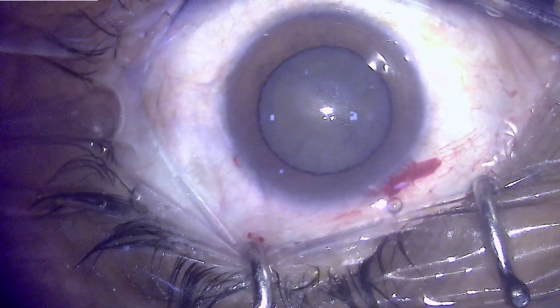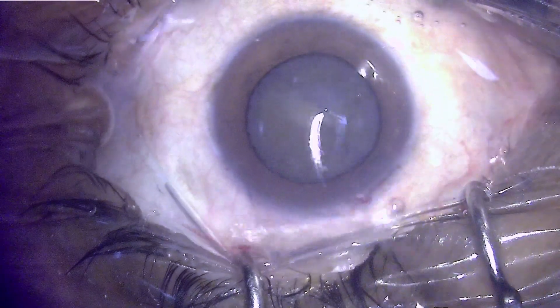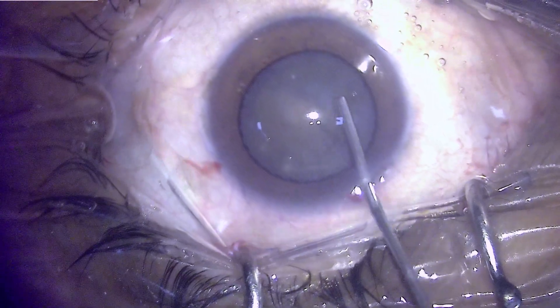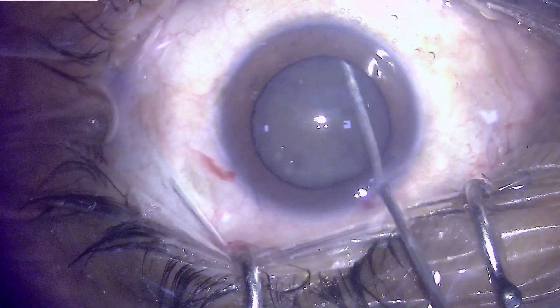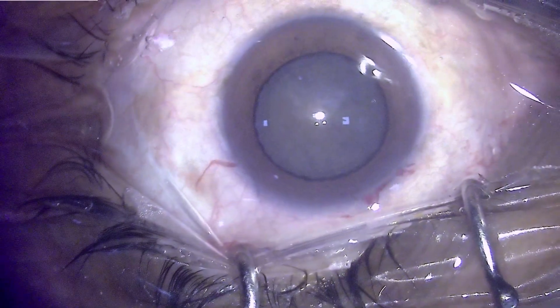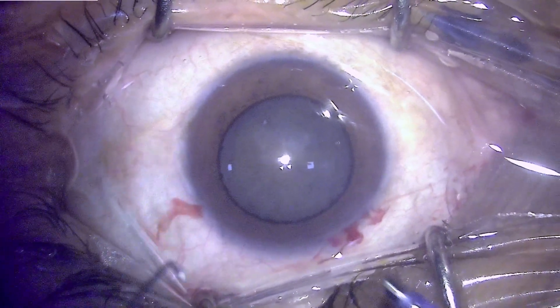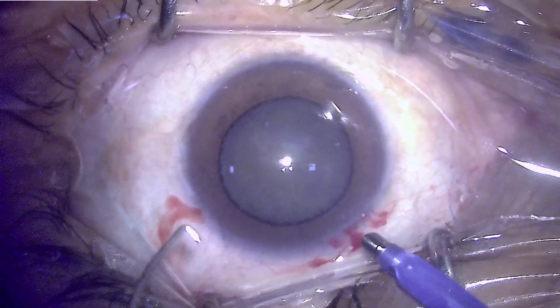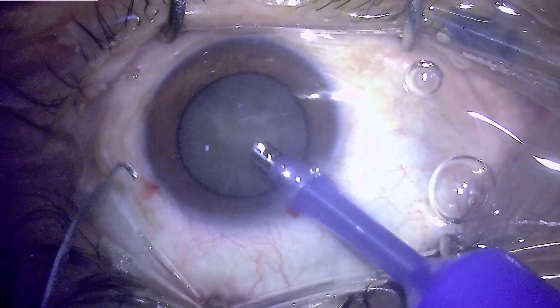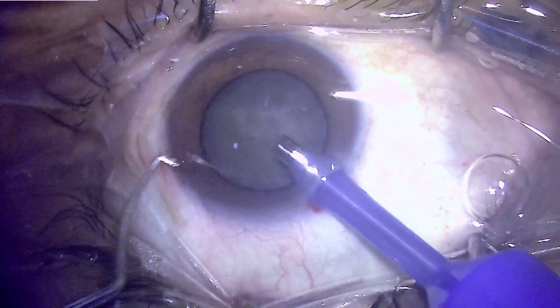The same thing happens when phaco power or ultrasound energy is applied on the nucleus piece. The force pulling the nucleus towards the phaco tip is the fluid aspiration, so there has to be a delicate balance between them. Otherwise there will be a lot of chatter, meaning the pieces simply fly away after touching the phaco tip.